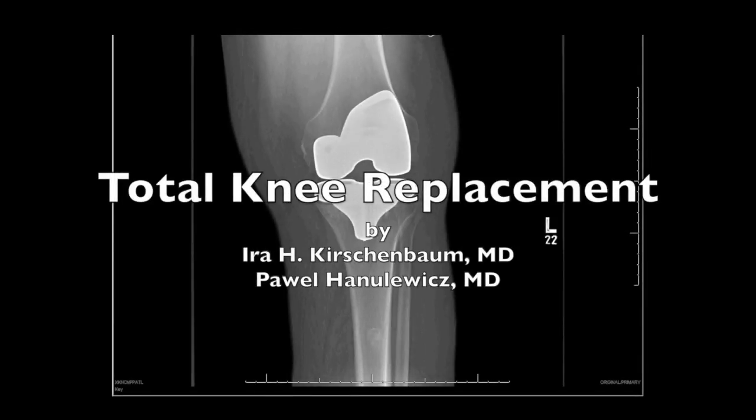The following video presents the step-by-step techniques of the standard primary total knee replacement surgery.